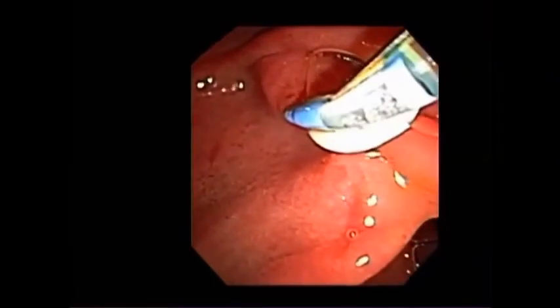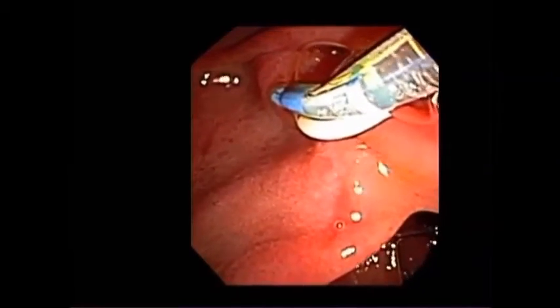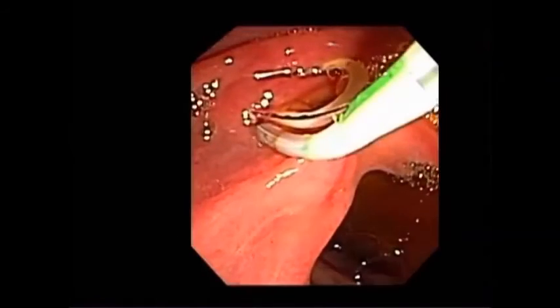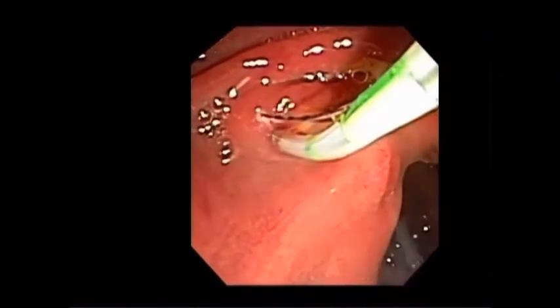the bile duct is now cannulated, and a cholangiogram is performed. A biliary sphincterotomy is now performed using a standard sphincterotome.